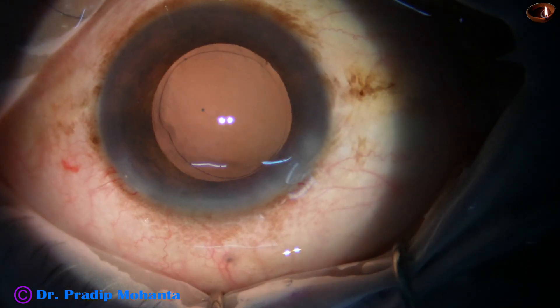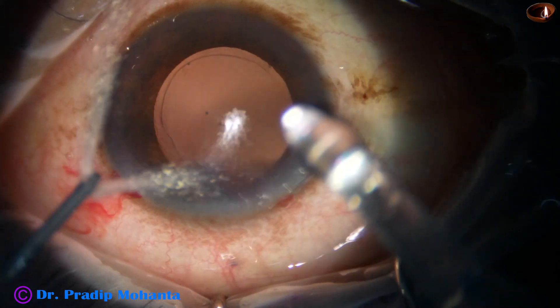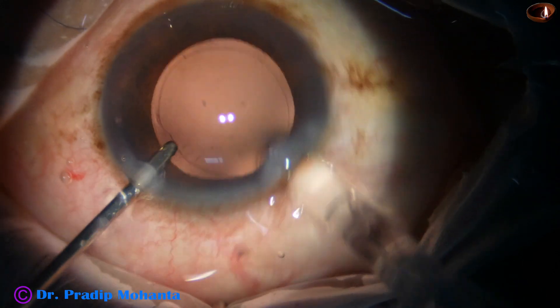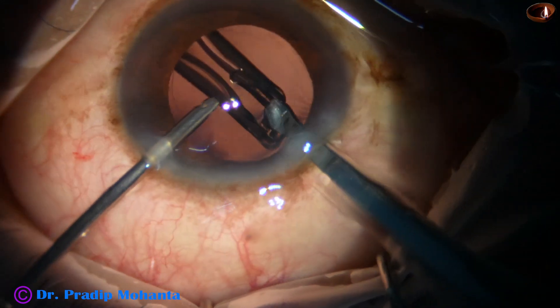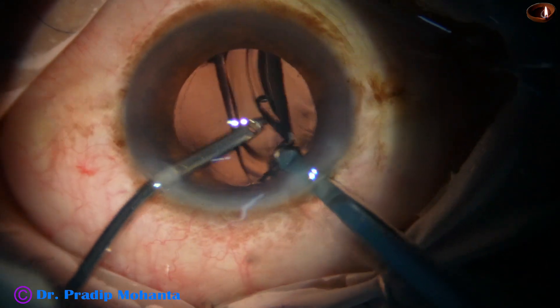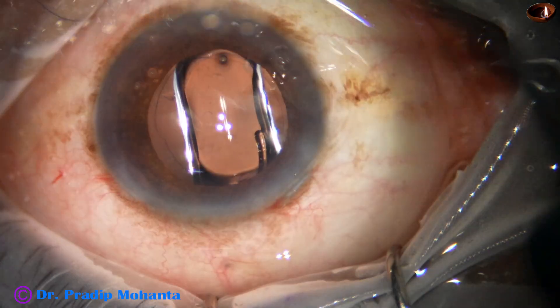The main wound has been enlarged to about 3 millimeters and here goes a hydrophobic acrylic single piece monofocal intraocular lens. The cartridge was a B cartridge, which is why we enlarged the main wound to about 3 millimeters.